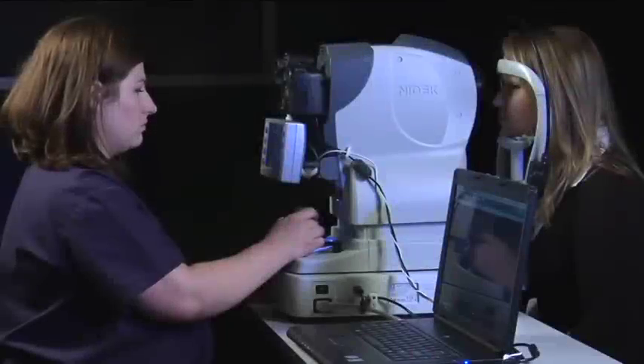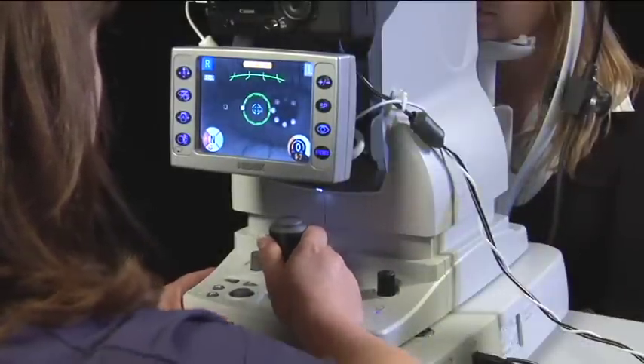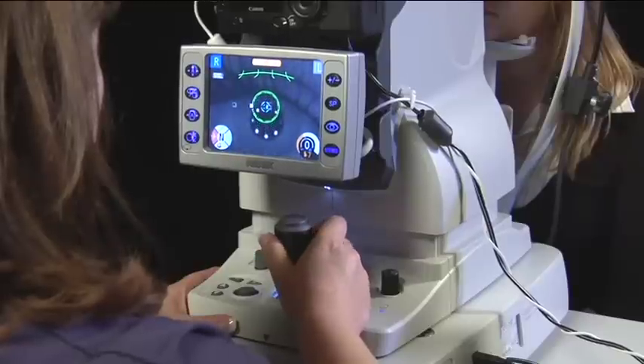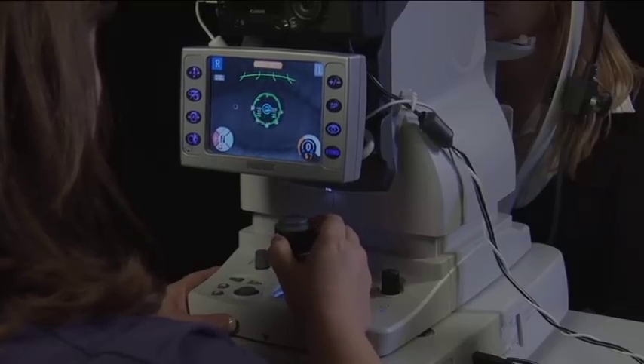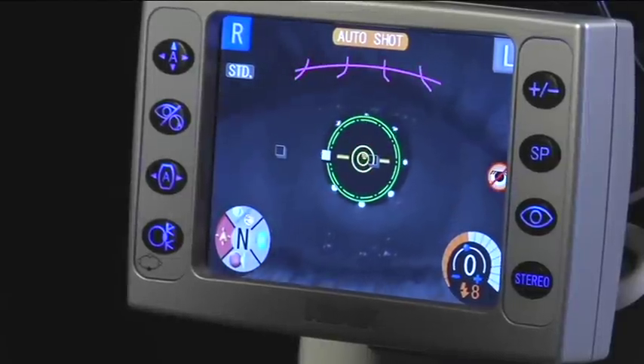After aligning the patient, place your right hand on the joystick and keep it straight up. Place your left hand on the base. Push the base towards the patient and move the camera up and down by twisting the joystick. The green rings or pupil markers should be placed in the middle of the circle of white dots.